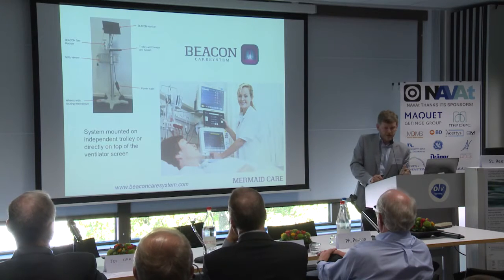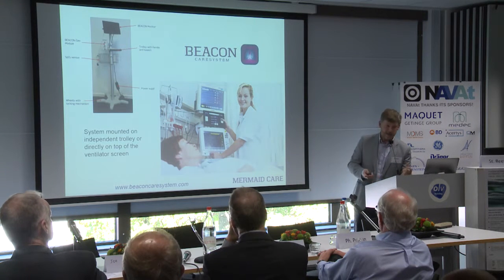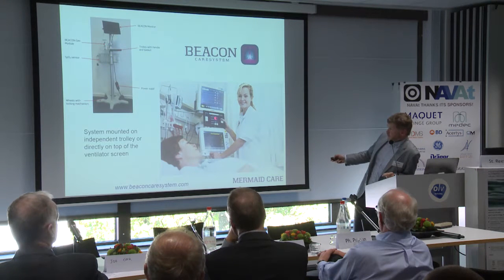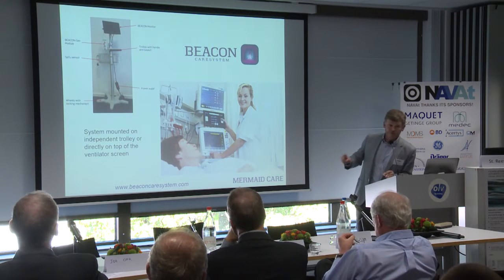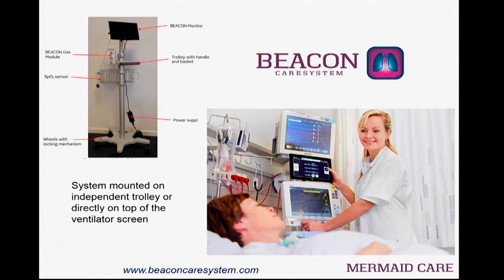We were very fortunate a few years ago that there came a spin-off company from the university, and this is the one where I have the conflict of interest, who decided to try and build this and put it bedside in the ICU. So they have a little tablet now connected to the ventilator, as well as that indirect calorimetry device, so we can measure the VO2. So now we can do that trick of setting the FiO2 dependent on patient need.